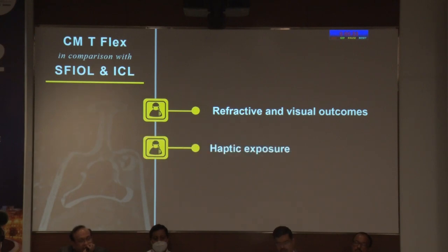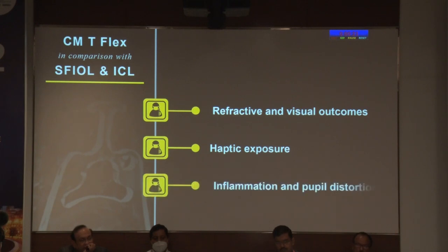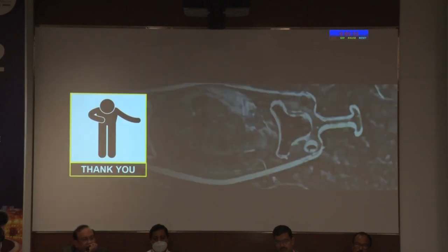When both the standard scleral fixator and the CMT flex lens are compared head to head, we see that the CMT flex lens has lesser haptic exposure. And when I talk about complication profiles like inflammation and pupil distortion, we see that CMT flex is very comparable to the standard SFIOL and really better than the iris claw lens. Thank you for the opportunity and time.